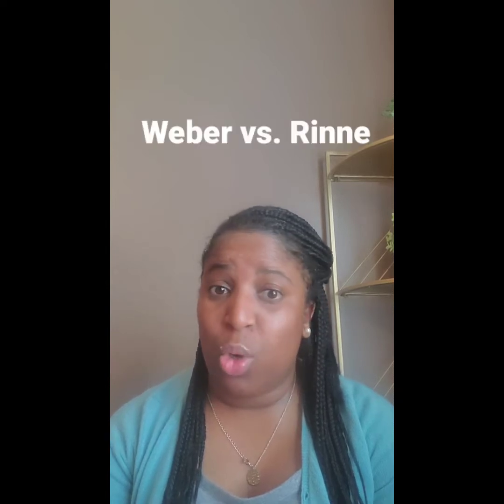This week we are discussing Weber versus Rinne. Rinne? Rhine? I hear it so many different ways, but you know the exams that I'm talking about. We utilize this assessment tool to assess patients who have hearing loss. So if a patient comes into your office complaining of hearing loss in their right or left ear, you're going to want to do these two exams using your tuning fork to assess and see if it's conductive hearing loss versus sensory neural, okay? So let's talk about it.